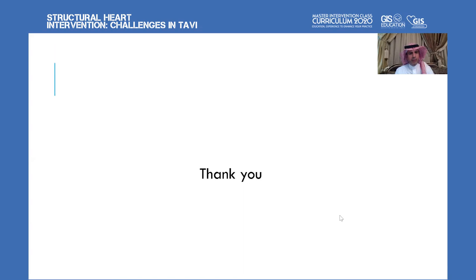Yes. I have a comment. Same. The valves usually are anchored by the annulus. Dr. Sen, comment, please. Valves are usually anchored by the annulus itself, not by the sinotubular junction or the aorta. And once the valve migrated anteriorly, it has to be snared, and another valve has to be deployed in the same session. Because definitely, it will not function normally, and most likely it will migrate more until it finds a stable position. I agree that the valve should be deployed in the same session.